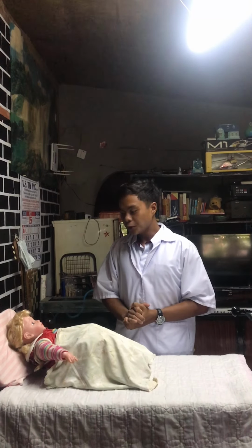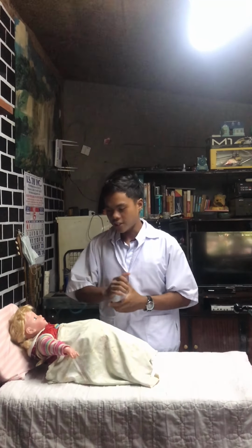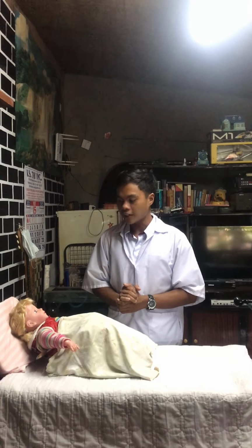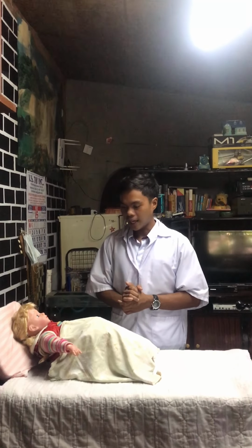Good morning, ma'am. I am Ligi Wednesday Okibuyan, your student nurse for today. And by the way, what is your name, ma'am? Okay, Marites. Let me check the wristband. Today, ma'am, we will perform a urinary catheterization. Are you allergic to iodine, ma'am?